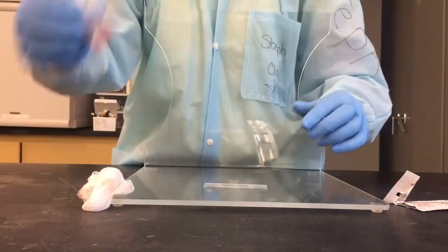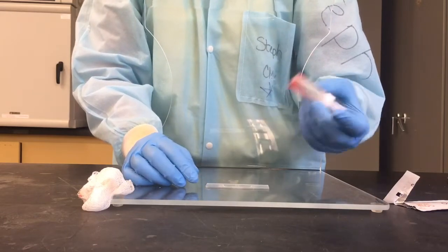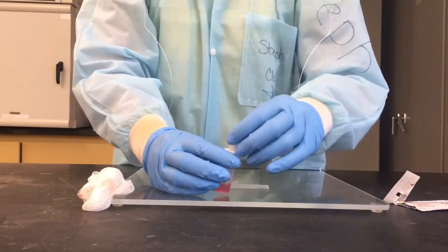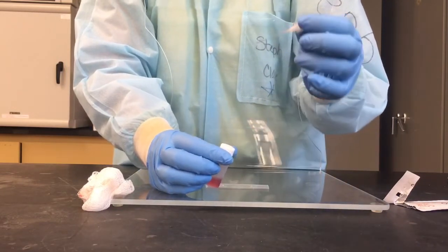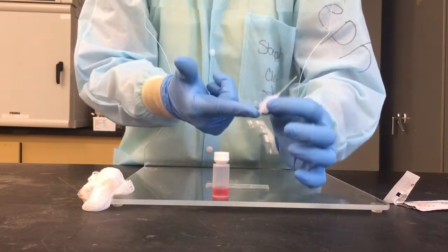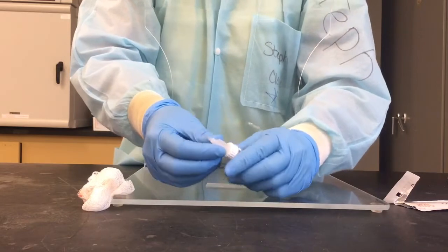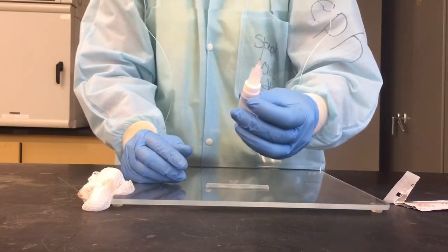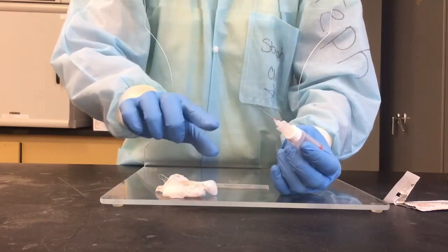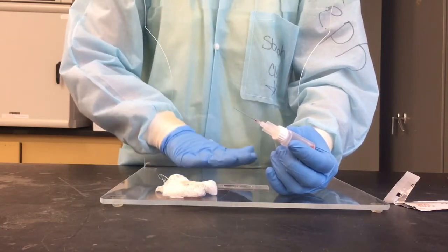So when I take my specimen off the rocker again, this should be all nice and mixed together. Once I take it off, this same assembly is now going to also become my dropper. So what I'm going to do is take the capillary piece out, flip it upside down, and then this piece of the hub right here is going to attach into the top of the reservoir bottle. Once I have that seated in here, it now becomes a dropper. But I need to make sure that I get all of the residual air out of here, because once I start loading my hemocytometer, I don't want any air bubbles. I want nice, full, and complete drops.